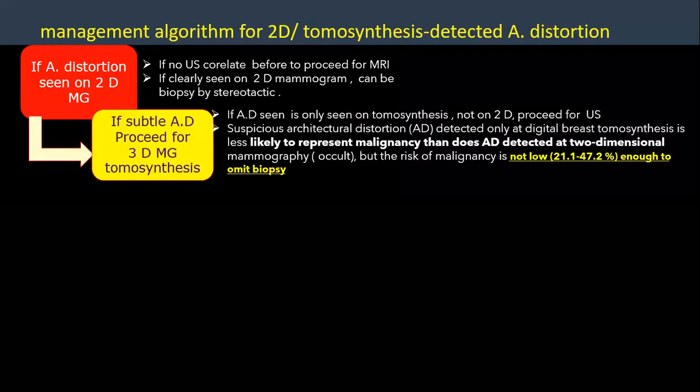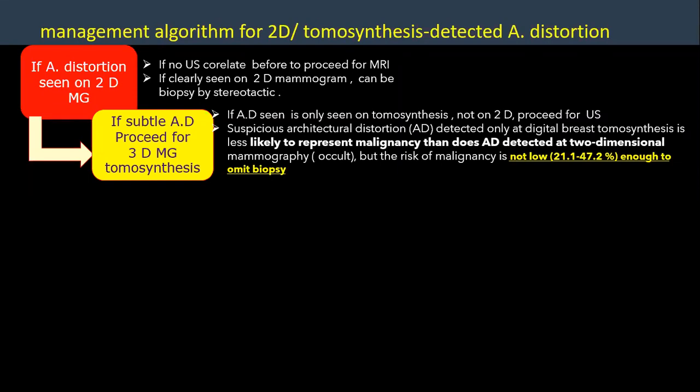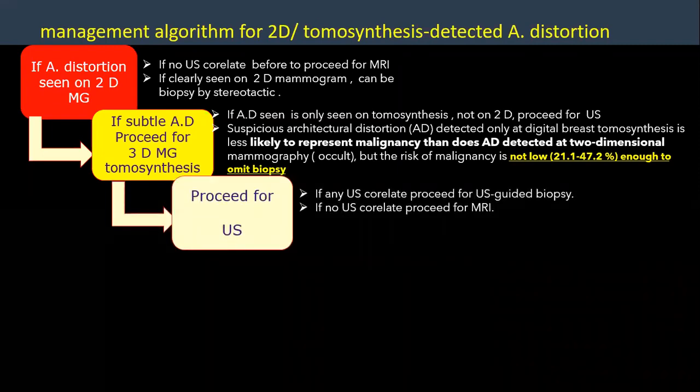If you don't have it, proceed directly to ultrasound. And if you have done the tomosynthesis and proven the architectural distortion, also proceed to ultrasound.